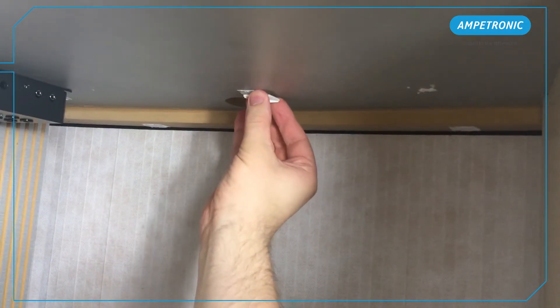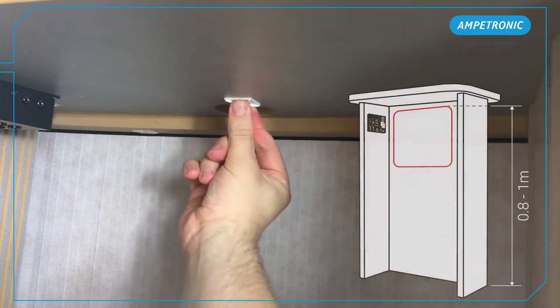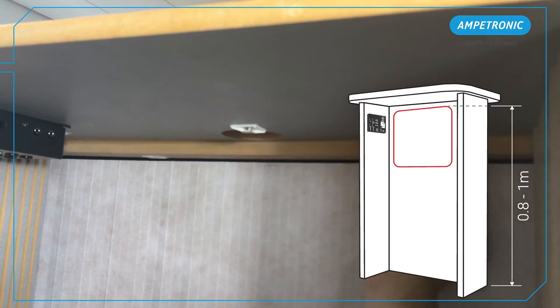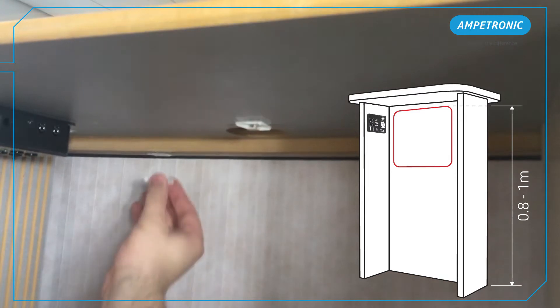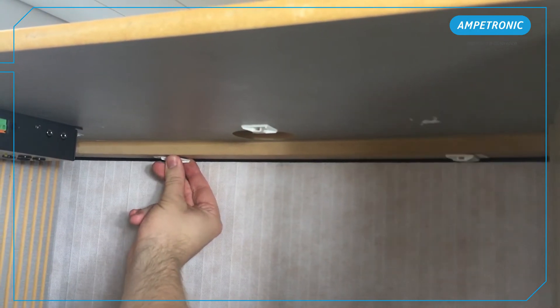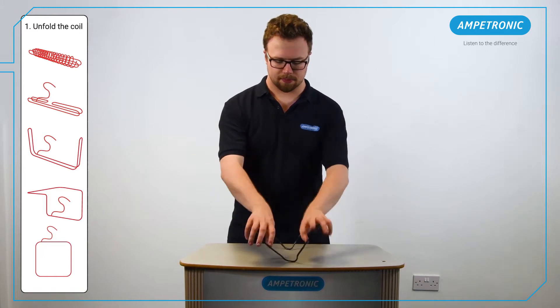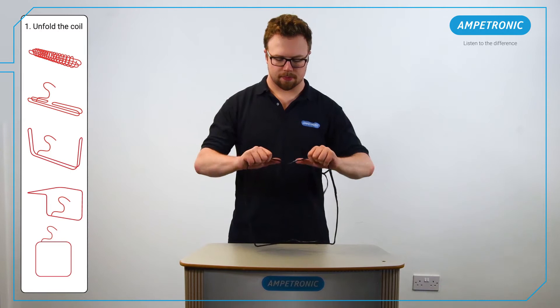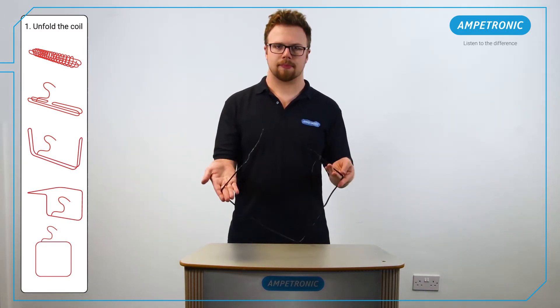Define a suitable position to install the loop coil. This should be directly in front of where the customer is expected to stand, with the top wire of the coil between 800 millimetres and one metre above floor level for standing height use. If necessary, due to limited space, the coil can be folded 90 degrees towards the staff side. This is especially useful on lower desks, as it will make the field travel further vertically, but will lose some horizontal distance.